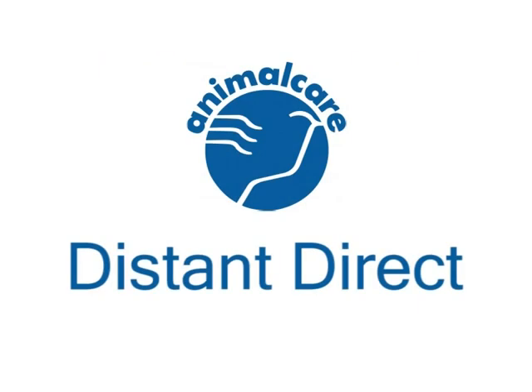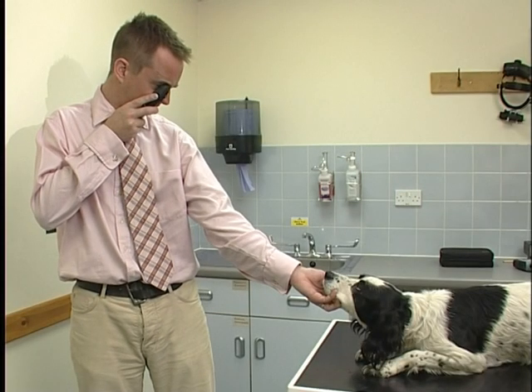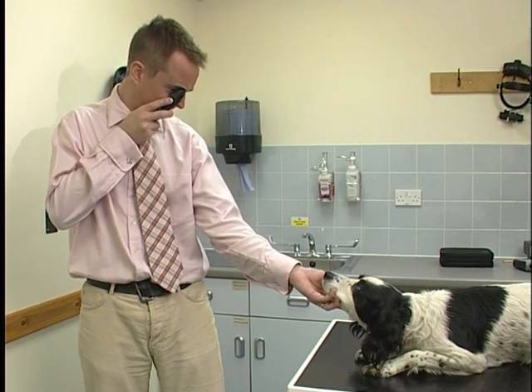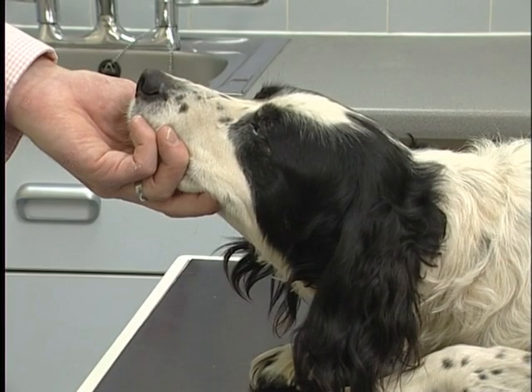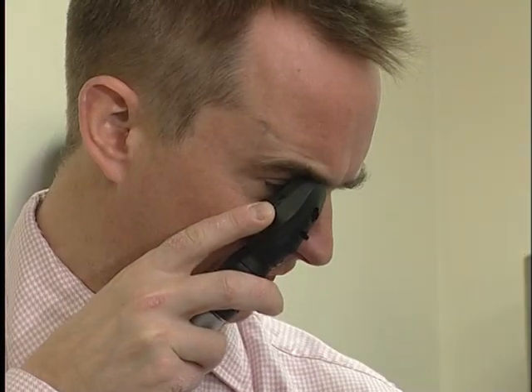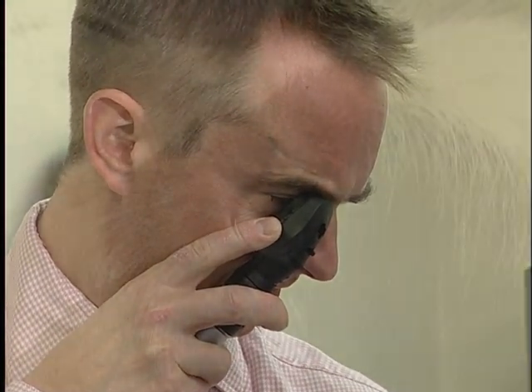Distant direct is dramatically underused and will give you a lot of information about opacities within the visual axis. This technique requires that from arm's length away, the observer looks through the ophthalmoscope on a setting of 0 diopters for a normally sighted person and uses the tapetal light reflection to assess whether there are any black opacities present within the visual axis. These may be located anywhere from the precorneal tear film through to the retina.